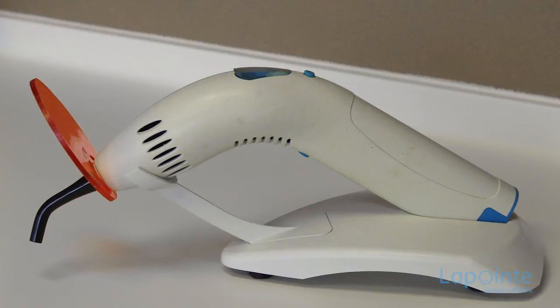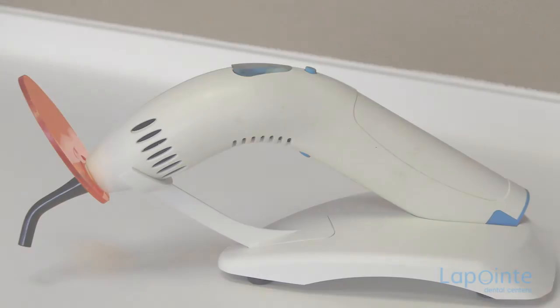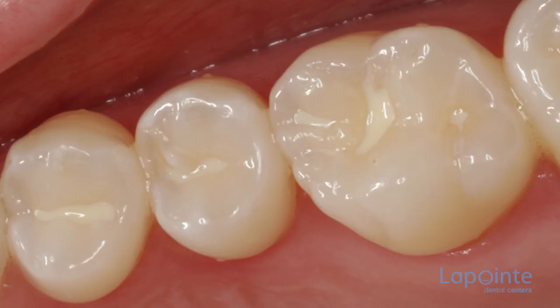Once the sealant is applied, it is hardened with a lamp especially designed for this purpose. The sealant is now hard and the job is complete. A sealant that is well applied and well maintained can last many years.